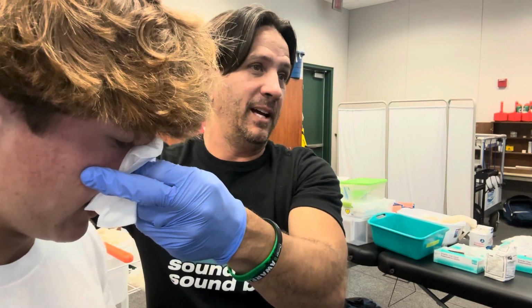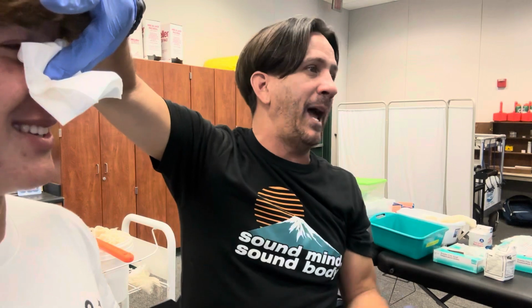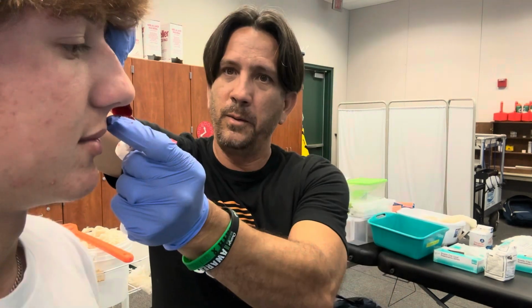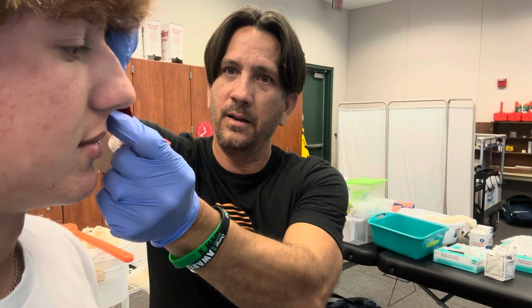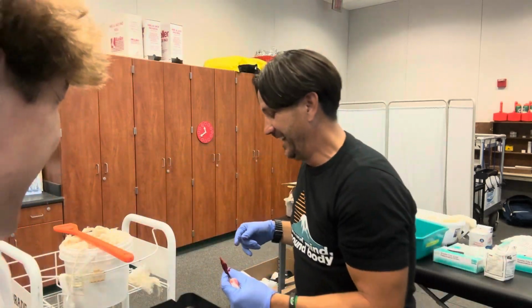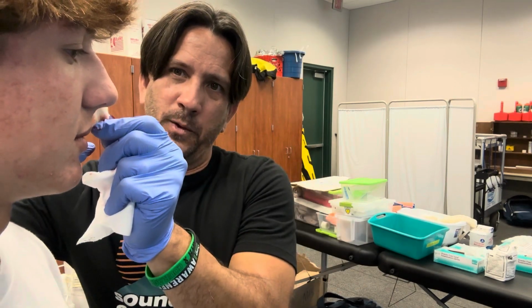After 5 minutes, I'm going to pick his head up. Usually what I'll do is take my other hand and look underneath to see if that BleedCease has absorbed a lot of blood. The entire BleedCease is absorbed with blood. So at that point, I'll remove it. Oh my God, that's so gross. So then I'll fold it and I'll put another one in.